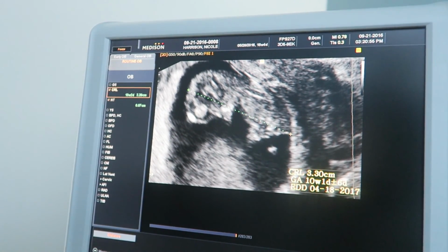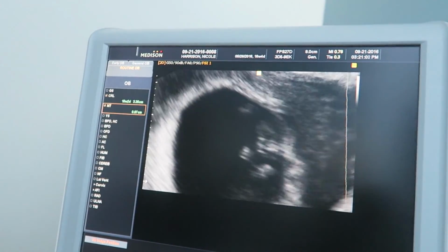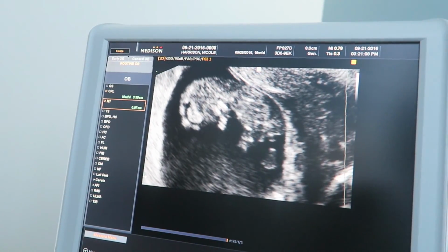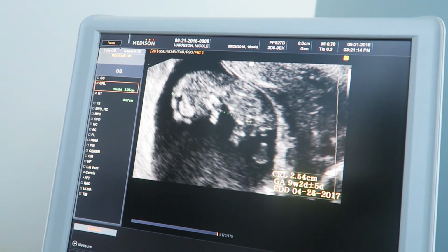I'm measuring just a little less than the other one. Let's see if I can get it just to match. Come back. I'm going to push on you a little bit. So this one's still an embryo. It's not quite a fetus yet. There we go. That's a good rump shot. How big is an embryo, or how big would you guess that is? It's measuring about 1.25 inches.